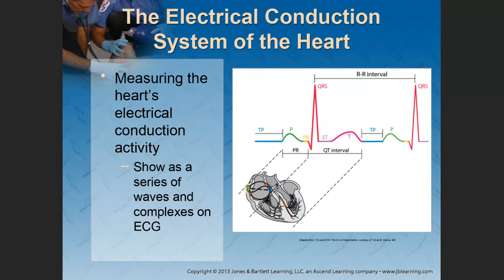If you don't ask any questions, it's going to be my assumption that everything is crystal clear. Yes, Miss Beckford, go ahead. Sir, I didn't catch the part when you said if the width of the QRS complex is greater than 3 small boxes. I didn't catch what you said after that.